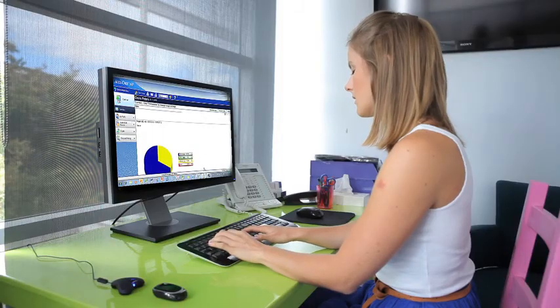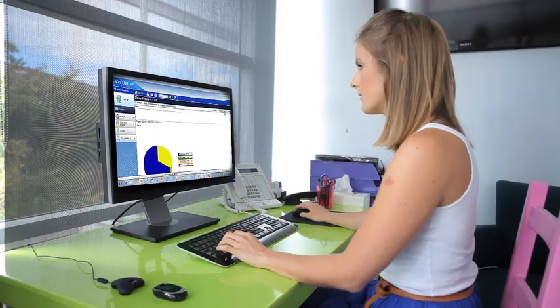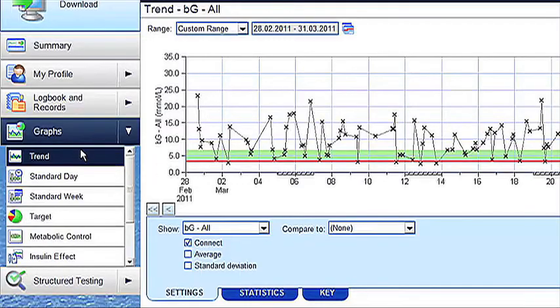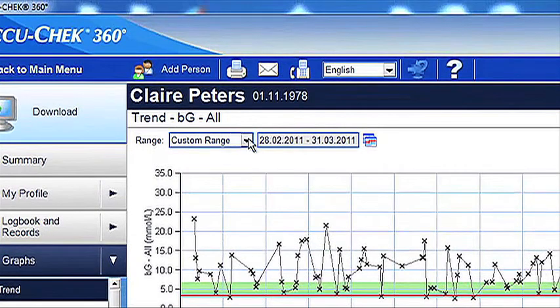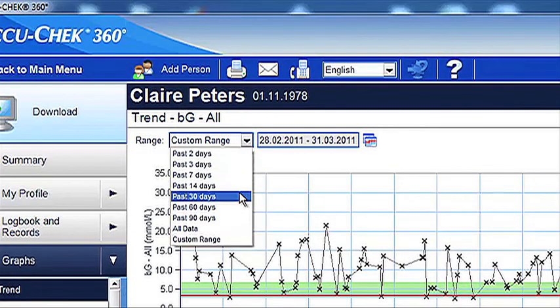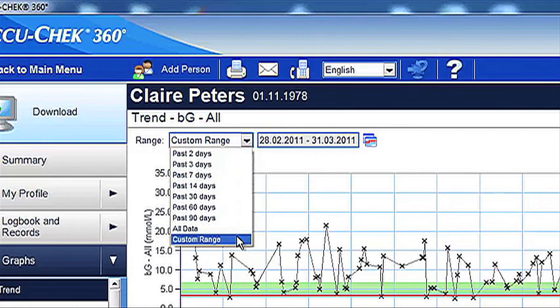Let's take a look at some of the key graphs that may be useful in getting a clearer picture of your diabetes management. In the trend graph, you can view your blood glucose results over a specified period of time — for instance, over the past 30 days, 90 days or even a customised date range.